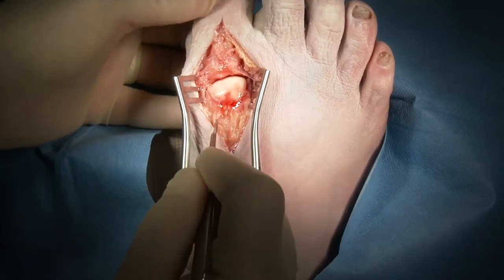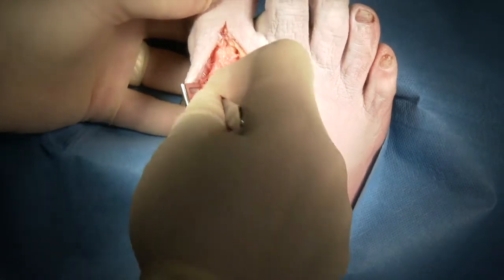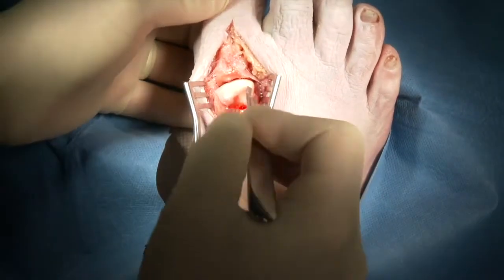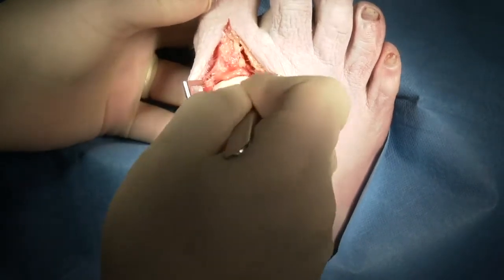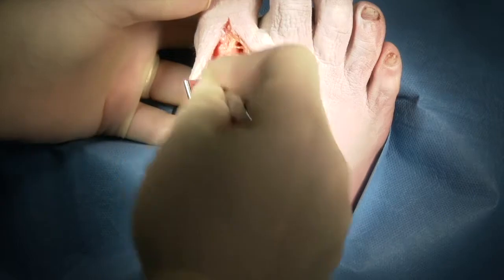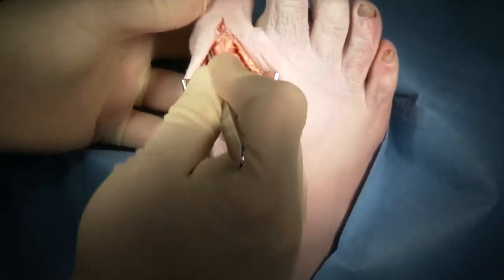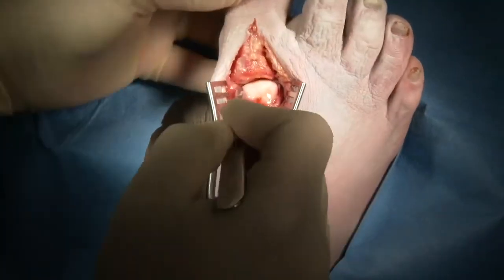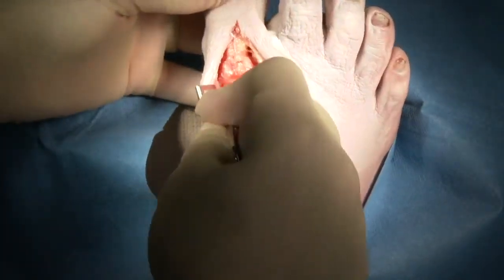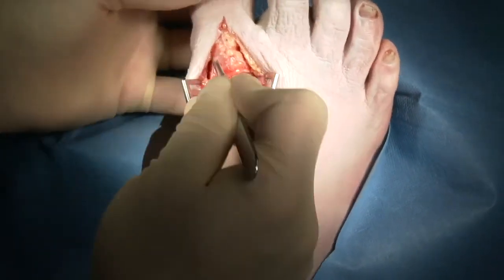You can see here on both sides of the joint the alignment. We're going to come over on the lateral side and release the collateral ligaments off of the metatarsal neck, then release both the collateral ligament as well as the adductor tendon off of the lateral side, and the collateral ligament and the abductor tendon off of the medial side of the proximal phalanx. This allows you to plantar flex the joint and allows good visualization so that we can place our reamers.